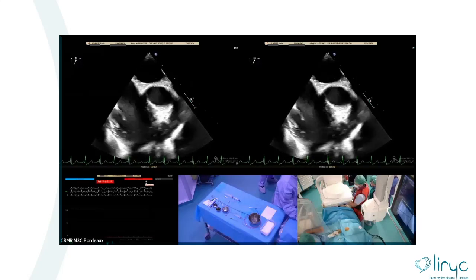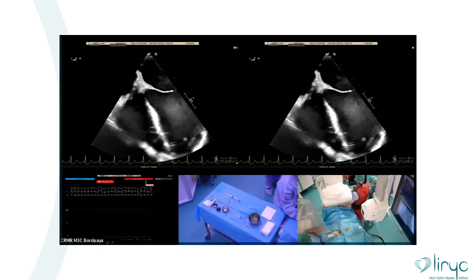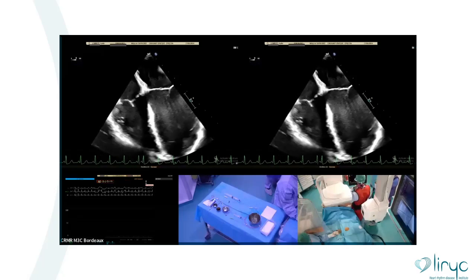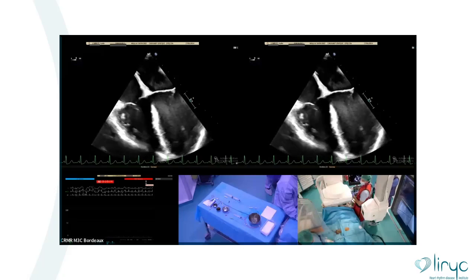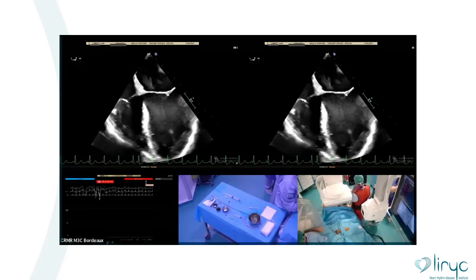Yeah. Okay. So Mark, we plan to implant a 10-8 MFO. Just to go on, we would like to introduce our guest today. He's coming from Peking, China, and so Dr. Pan.